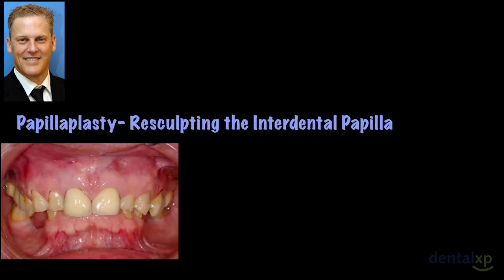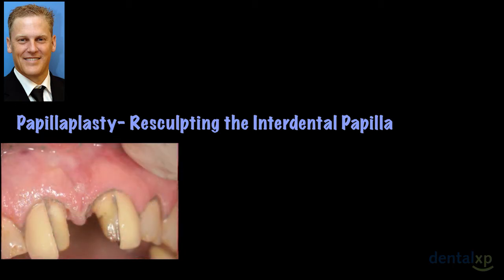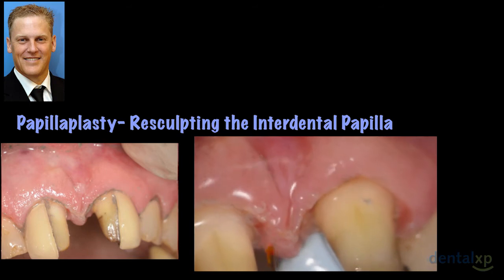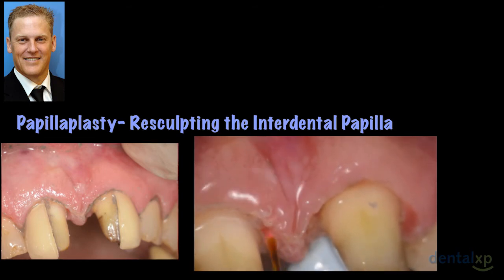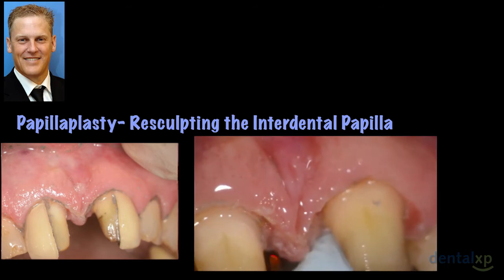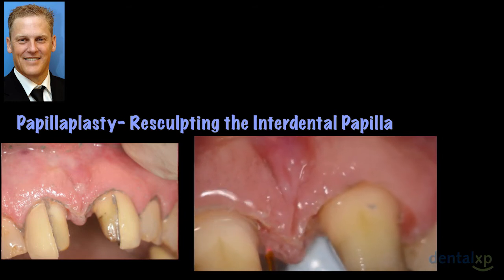At times we are required to shave down or plasti down tissue. This can be happening on a free gingival graft that's too thick. It can also happen in situations where old crowns are removed and an existing diastema is present. An all-tissue laser like the BioLase I+ here can be used to plane down or plasti the tissue and create a more ideal shape to the papilla.